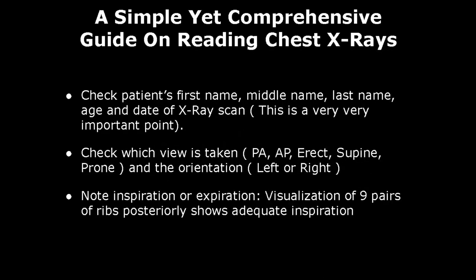First point is to check for patient's first name, middle name, last name, age, and date of x-ray scan. This is a very important point. Make sure you do not confuse or mix one patient's x-ray scan with another patient's, as this can lead to completely wrong diagnosis of a patient and can have dire consequences.